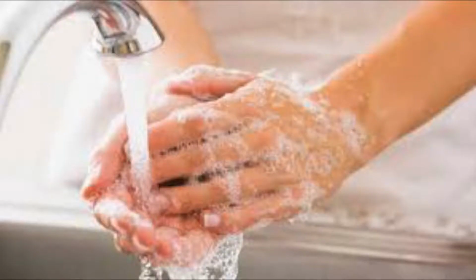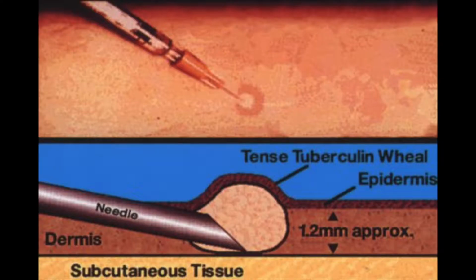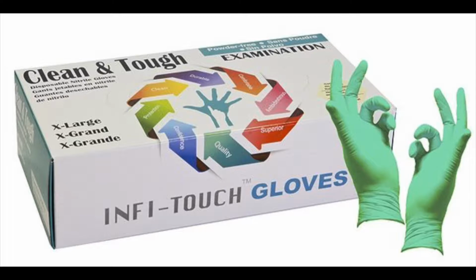No? Good. Then if you're ready to proceed, I'll ask you to roll up your sleeve while I wash my hands and get some gloves. This injection will not be unlike other injections you've probably had in the past. I'll clean the area with some alcohol, insert the needle, inject the medicine, withdraw the needle, and lightly wipe with a cotton gauze. This injection does not get covered with a bandage. I will draw a circle around the injection site with an ink pen so that it can be re-examined in 48 to 72 hours. Please don't wash off the ink until you've returned to the clinic for re-examination. Any questions? After patient's questions are answered and with the patient's consent, the medical assistant puts on clean, non-sterile gloves.